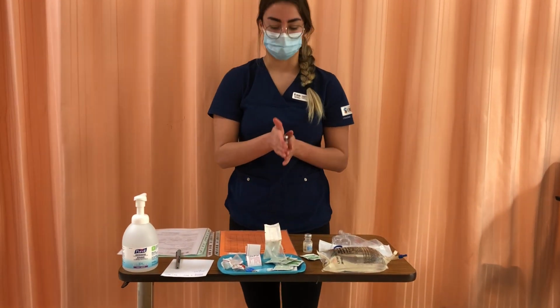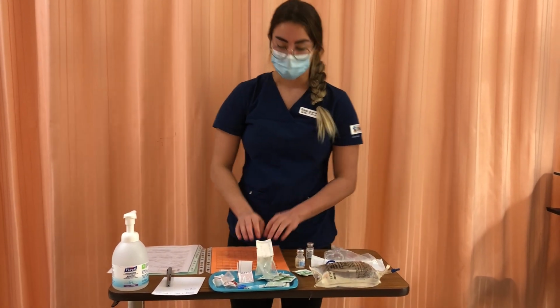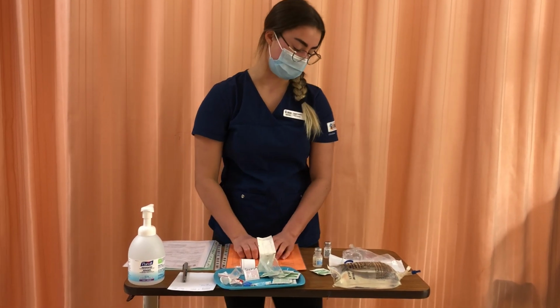Then I'll roll my vial in between my hands to make sure it's completely reconstituted. I don't see any sediment, so I know that we are okay there. Now I'm ready to pull my dose. So I've already calculated that my dose will be 4 milliliters of the medication.